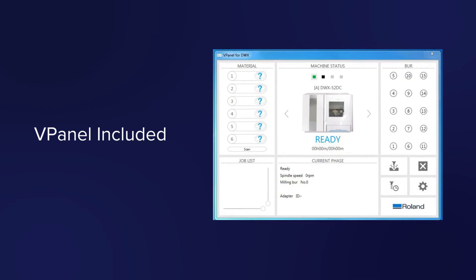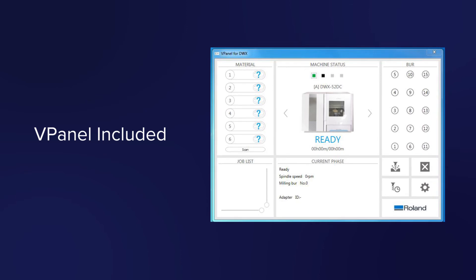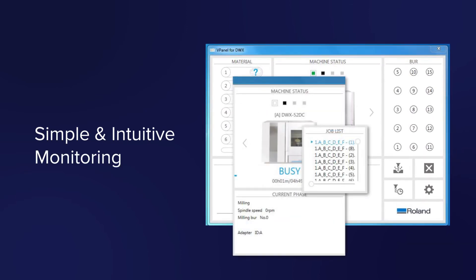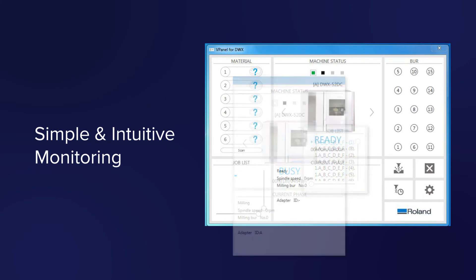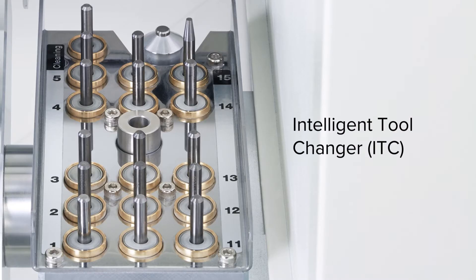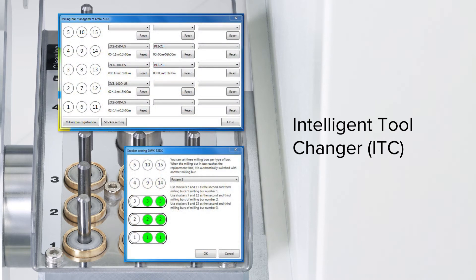Easy to use, every DWX52DC comes with Roland V-Panel, providing you a simple and intuitive way to monitor jobs and automate maintenance. Plus, it features an intelligent tool changer function that will automatically swap out burrs that have met their user-defined effective lifespan.